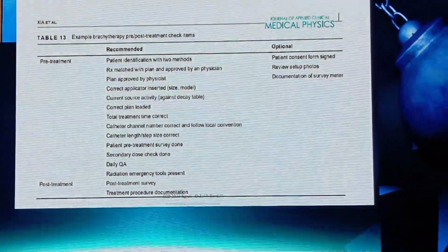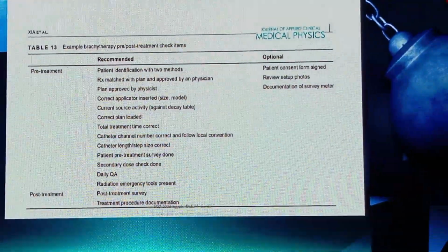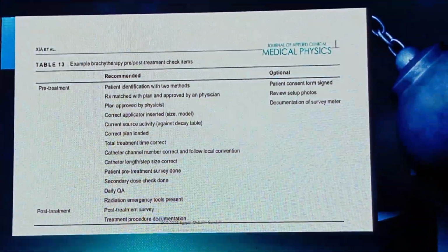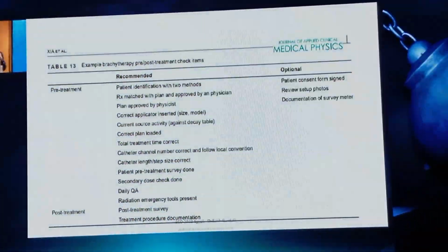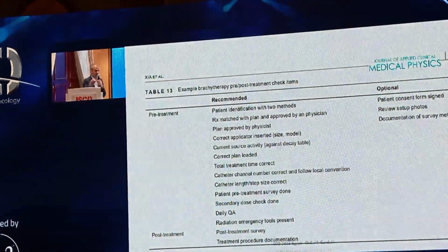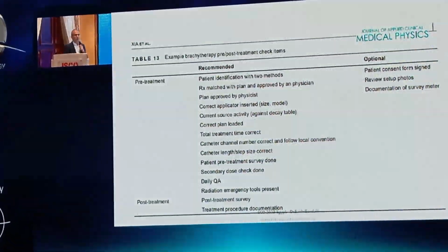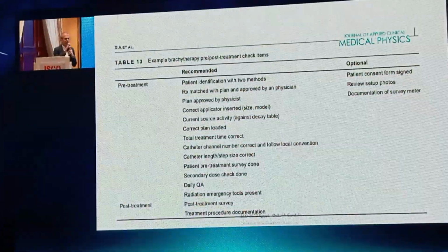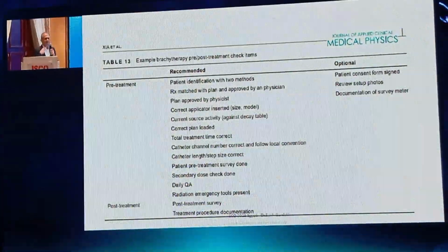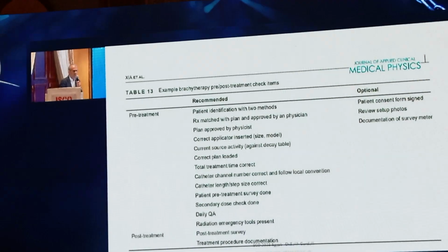You're like, pre-treatment, post-treatment? How's that thing gonna happen? Let me tell you one. One of our brachy patients had a PET-CT, but nobody knew about it, okay? You finalized the brachy. Our procedure was to survey the patient after brachy, because something might happen inside the applicator, correct? And all of a sudden, there was an alarm. We were all panicked for a second. Something was wrong. We called the radiation safety officer, and for like 10 minutes, we were sweating. It's unbelievable. Because we thought the source broke inside the patient. There might be a leakage.